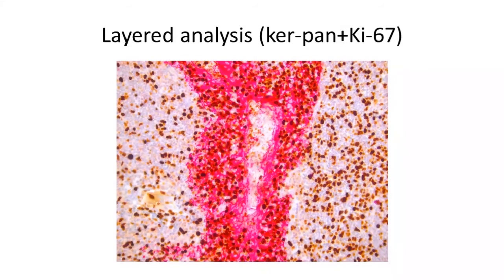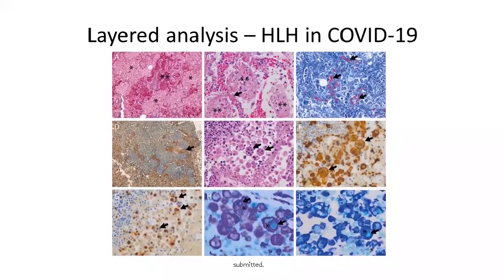Admittedly, these are, of course, only two markers at the moment. You can also do that in small biopsies with very much the same result. So here you can confirm that's an adenocarcinoma of the lung without having to do two separate stains. You can add in a different stain to that to see whether you can also exclude any squamous cell differentiation.